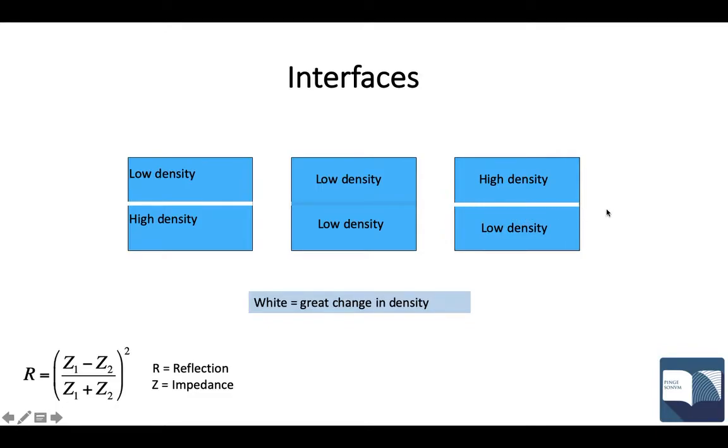So when the difference between the density is not important, that the difference is from a higher to a lower or vice versa, the importance is the difference between the two tissues. We have strong interfaces, such as between muscle and bone, or between muscle and lung. Two tissues with similar density have a lighter interface between them.